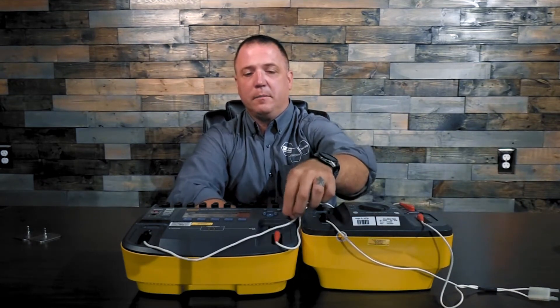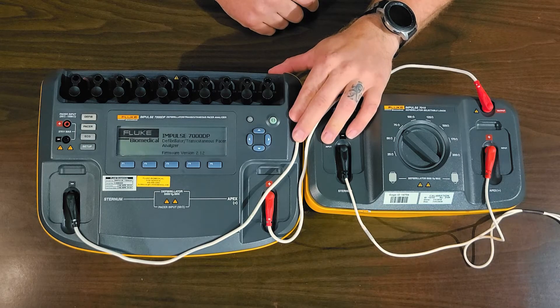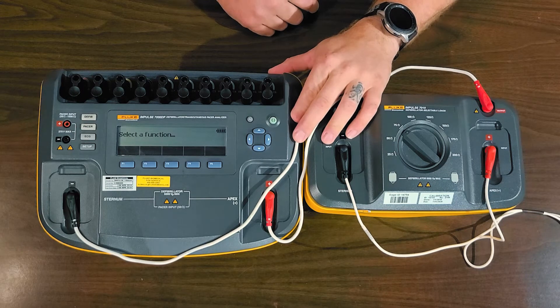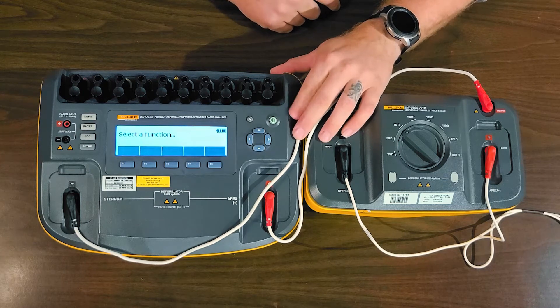Now I'm going to go ahead and power on the Impulse 7000. Wait a second while it powers up. Then I'm going to turn on my favorite feature — the good old-fashioned backlit screen because my old eyes aren't what they used to be.